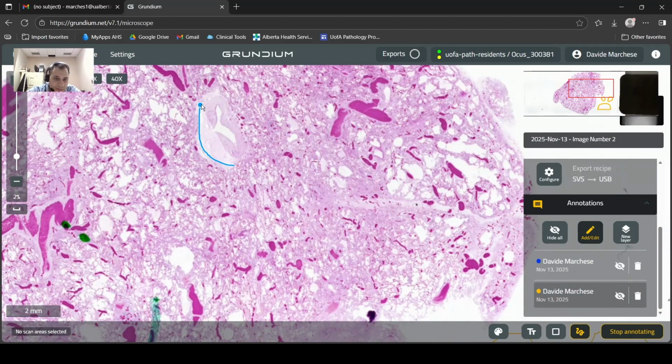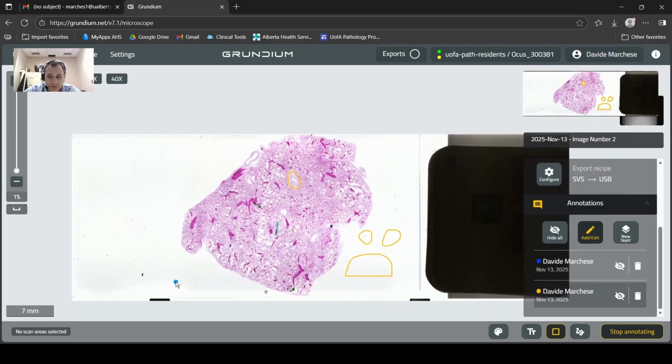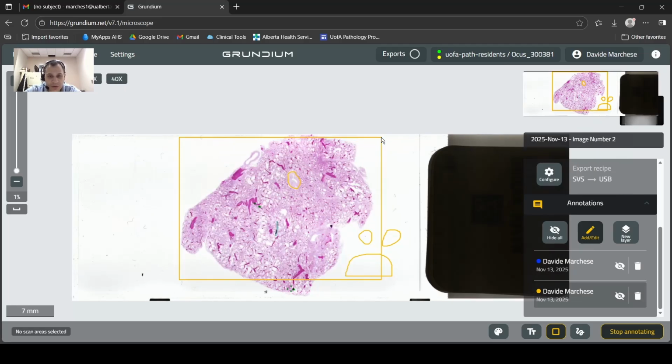This is insane. Okay. You can do stuff like that. Or maybe you wanted a box, and you could say, oops. So click once and drag, just like for defining the area. A little tricky on a trackpad.